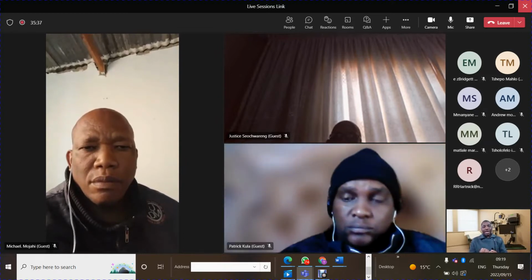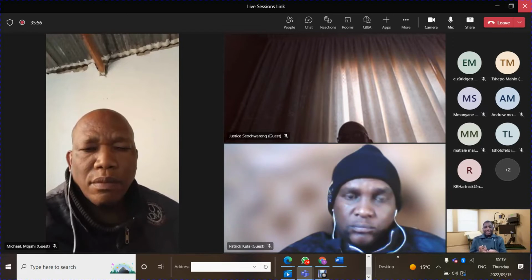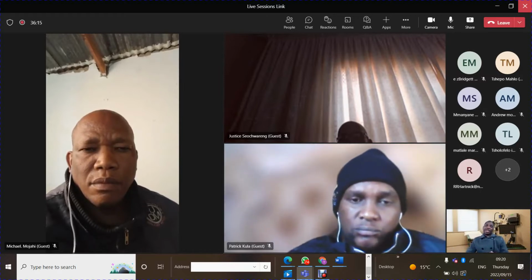So it's a combination of the fact that you have oxygenated blood and you have red and infrared light, one transmits, one receives, and then that pulsatile movement of the blood through the arteries in the site where the probe is. So it picks up both the color and the fact that there's a pulsatile movement of blood through the arteries. One transmits red light. You have your red and infrared. One transmits, one receives on the other side as the blood passes through the finger.